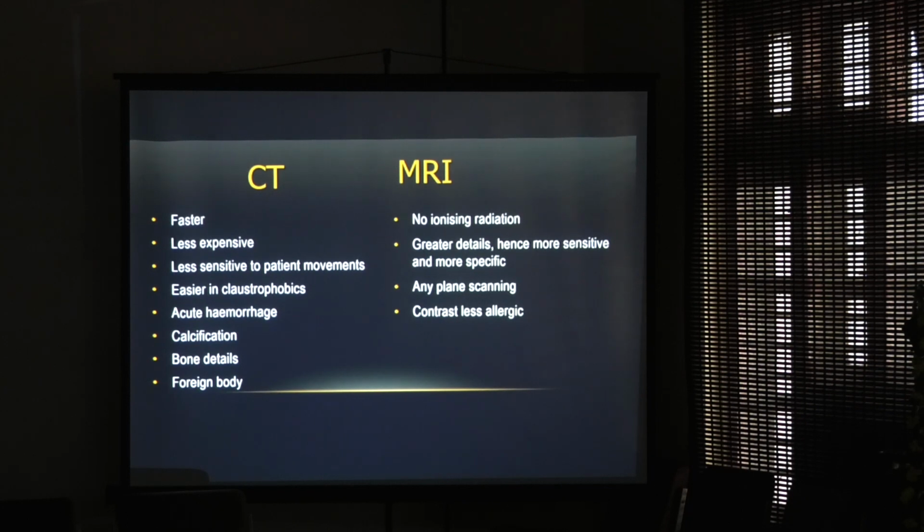claustrophobic patients. Hyperdense objects like hemorrhage, calcification, bone, foreign body, etc. are better visualized in CT than in MRI. In MRI, the main advantage is lack of ionizing radiation and a better spatial resolution.